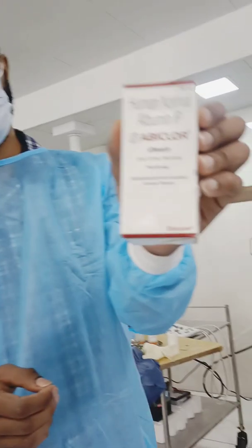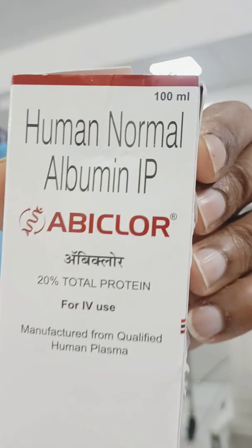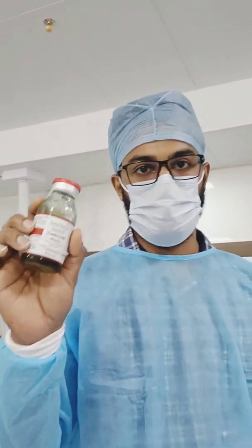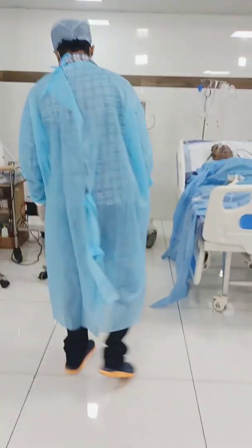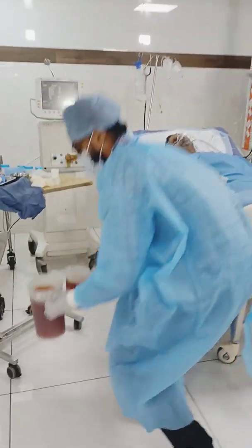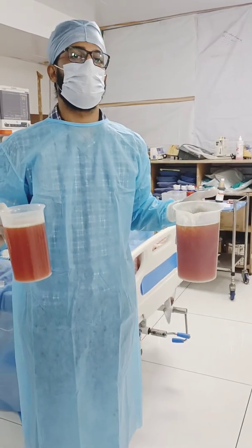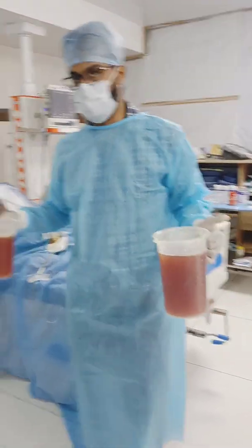This is human albumin. After a large volume of ascitic fluid is drained, it is absolutely necessary to transfuse albumin, which is a little costly but it's worth it. Now let's check out how much fluid we drained. The large cup is 2 liters and the small cup is 1 liter, so in total we have drained 3 liters.